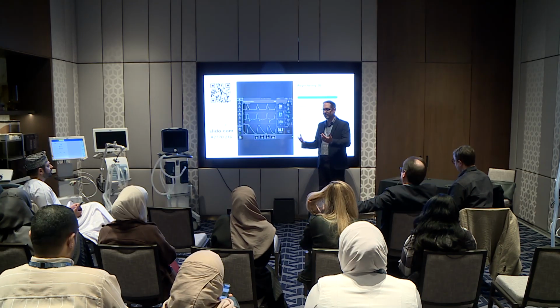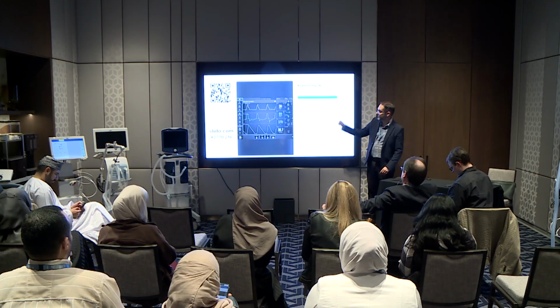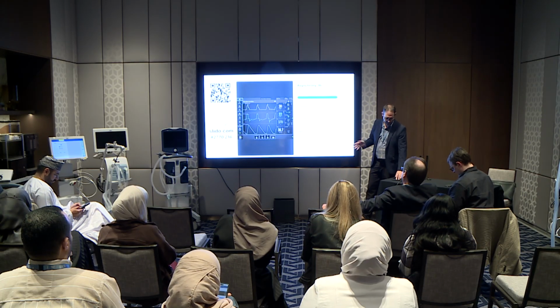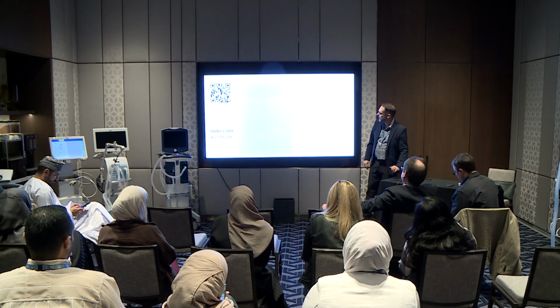If you had chosen early cycling, I would say, okay, I get it, it cycles off before they're done. Technically, it's early cycling, but reverse triggering is the main cause, and everyone that voted did choose that one. But if you had chosen this one as well, I wouldn't argue strongly against you that that was the right answer, and 100% of you did choose that. Okay.